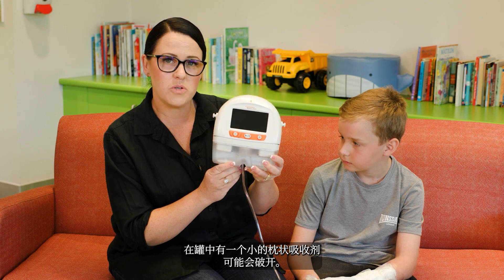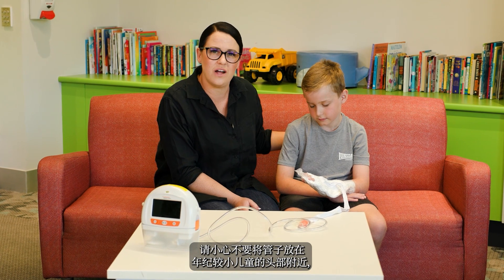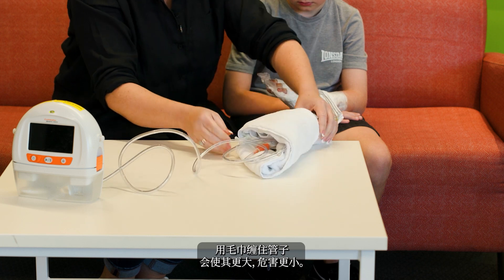There's a small absorbent pillow in the canister which may pop open — this is nothing to worry about. The machine prefers to be kept upright. Be careful not to place the tube near a small child's head as this could be a suffocation risk. Wrapping the tubing in a towel will make it fatter and less hazardous.